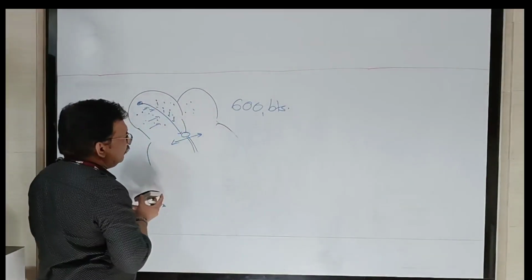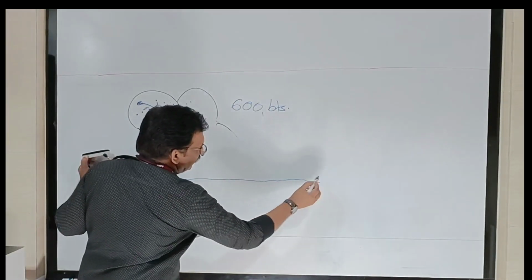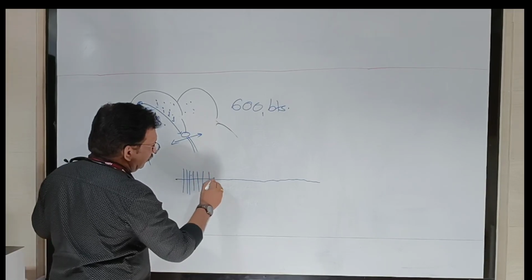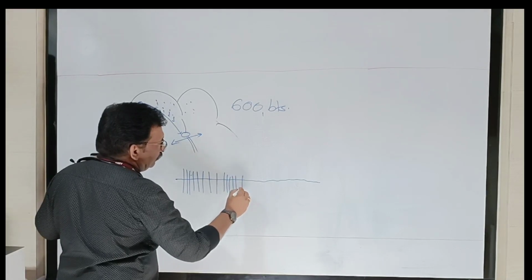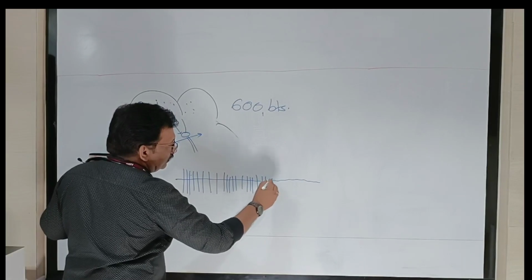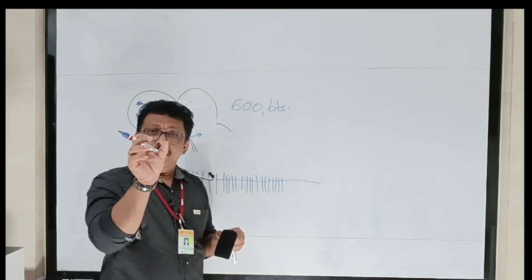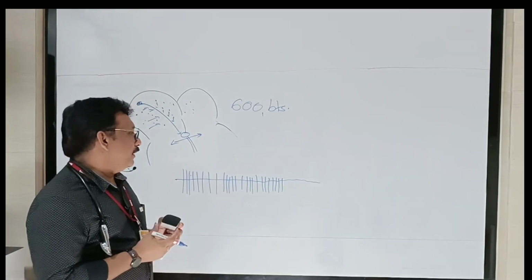So now you can see atrial fibrillation is wavy baseline. So this is wavy baseline, you don't see any P wave. Then QRS complexes are very fast and they are irregular. The space between QRS complexes is irregular. Some part it is narrow, some part it is wide, but we cannot predict what time it will come. Okay. So irregular QRS complex, the RR interval you can see will be varying. So that is atrial fibrillation.